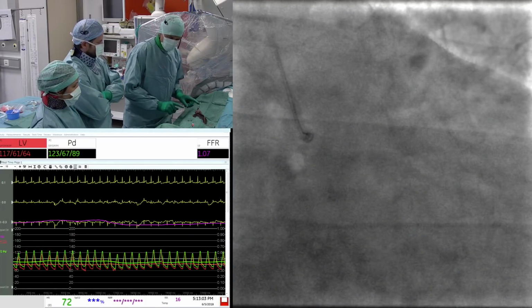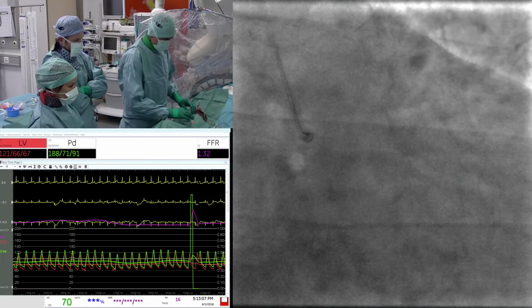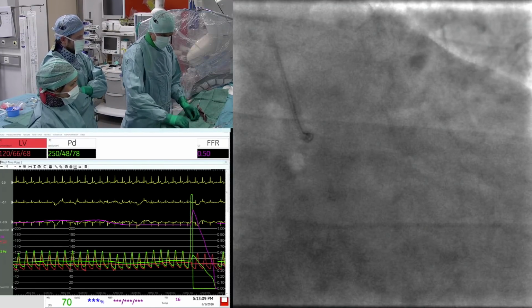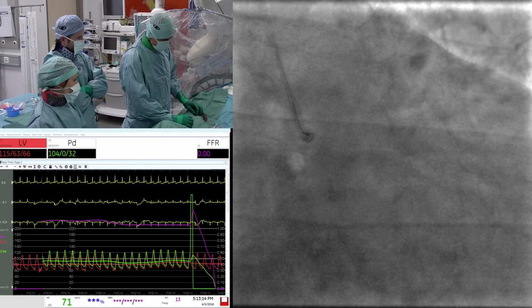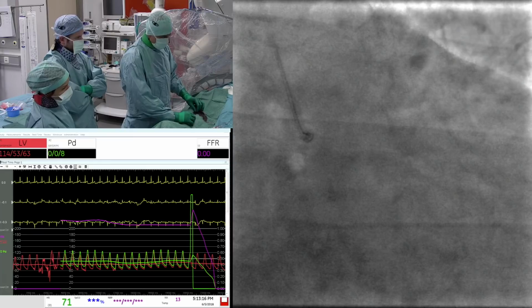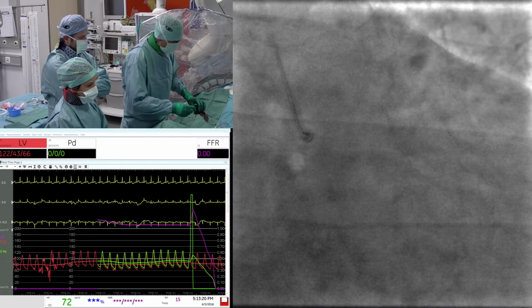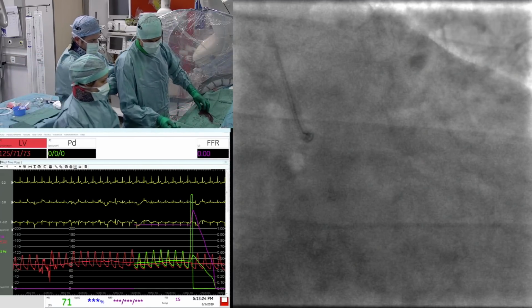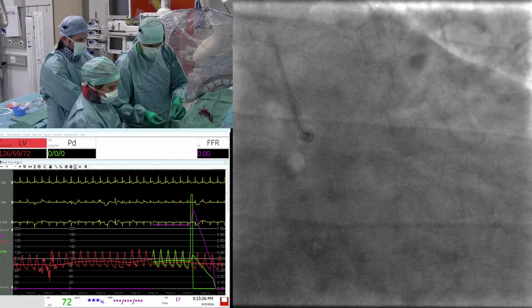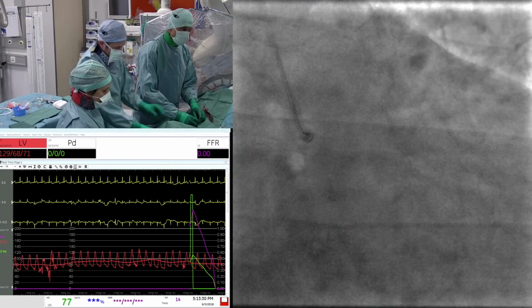The first thing I will do is pull back the needle. During many years, I have said, well, equalization can be done with a needle in the Tuohy, because if you use needles that are very small, this creates only a minimal error of 1 or 2 millimeters. But I think a minimal error is already too much, and I think we have to have really excellent measurements.